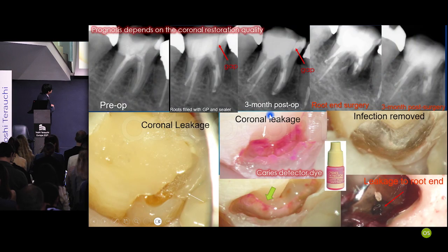So this is one of the cases I did 20 years ago. So here, this is pre-op. I retreated this tooth because of the small lesion here.